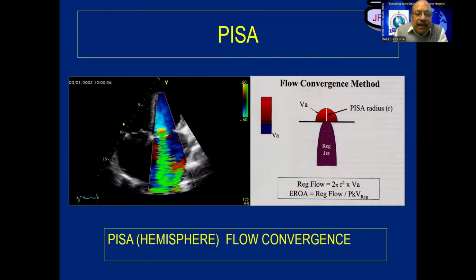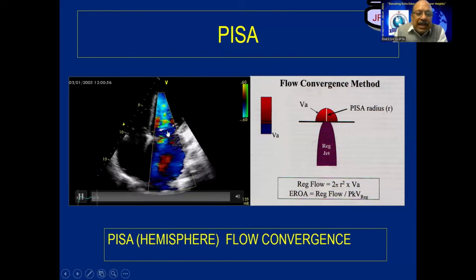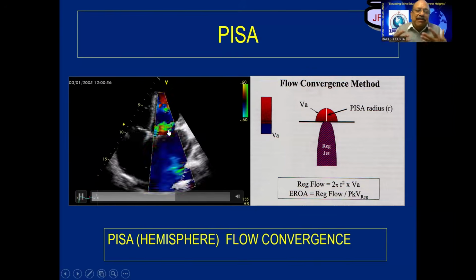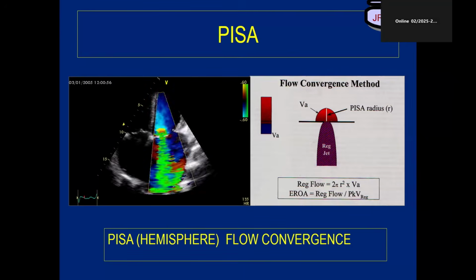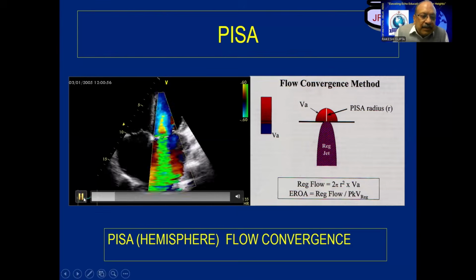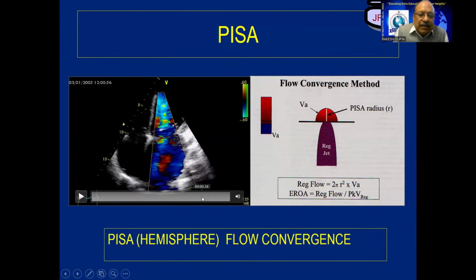Multiple rings are present in this picture. If you happen to see very carefully, it looks as if we have an early morning rise of a sun, something like that. Yes, sir. Correct? So I'm going to stop this for you and move my frame gradually.